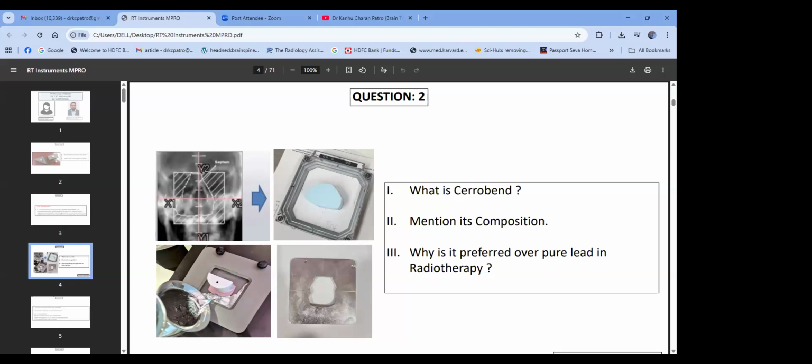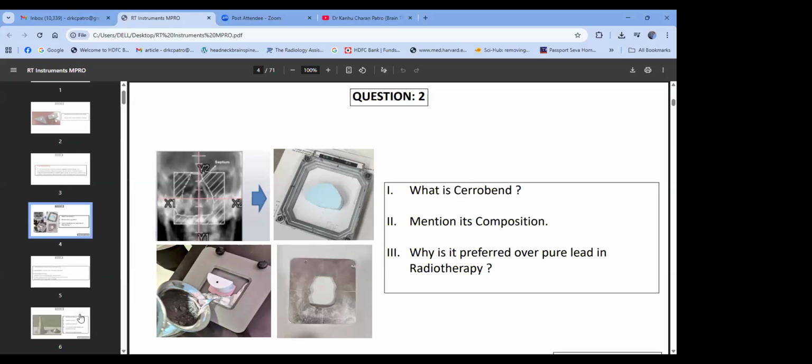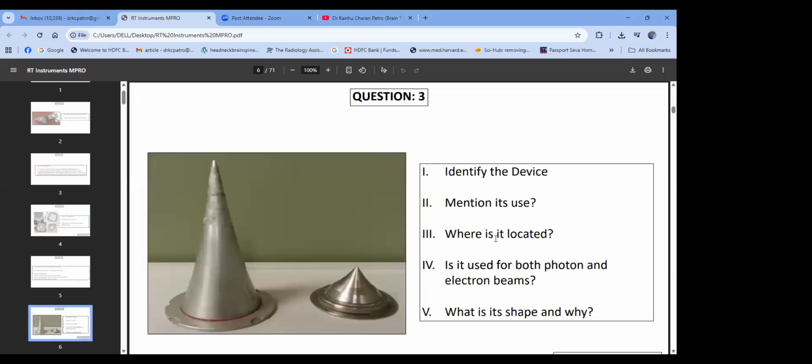When we are molding it, cadmium can release toxic fumes that are poisonous. So there are Cerrobend alloys which are devoid of cadmium. Instead of cadmium, the percentage of lead will be more, and that is called alloy 203. Here the bismuth will be 50% itself, but tin will be 18.8% and lead will be 31.2%.